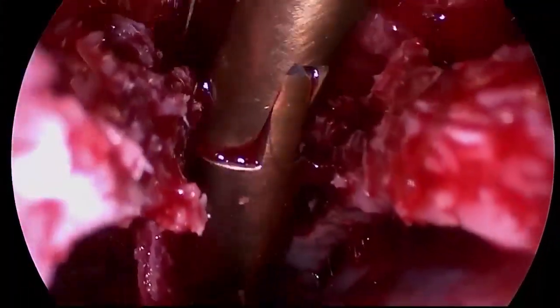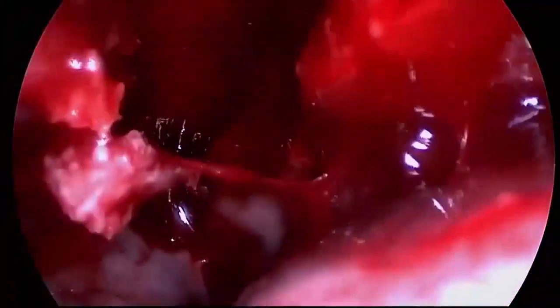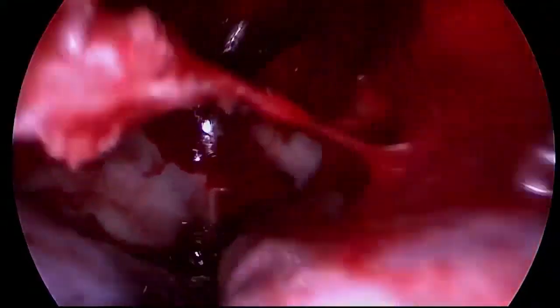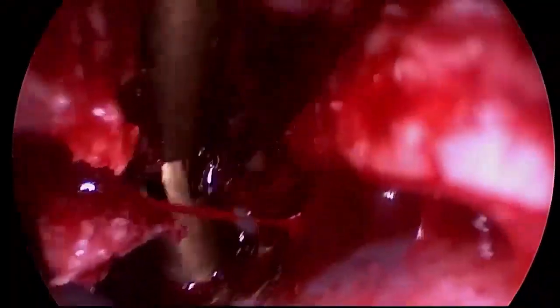Now a 30-degree rigid endoscope is placed under the bone to aid in the visualization of the bone removal. This allows us to then separate the dura from the overlying bone to do a bony resection in a safe fashion. On the left hand, you can see the suction is being used to depress the dura and expose the bony undersurface of the forehead.